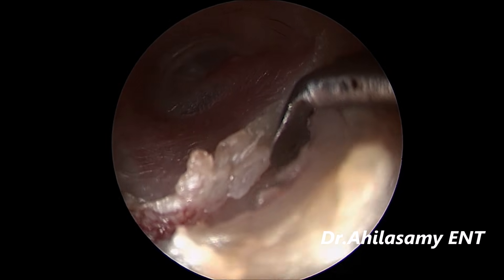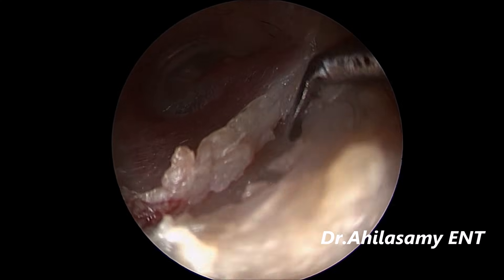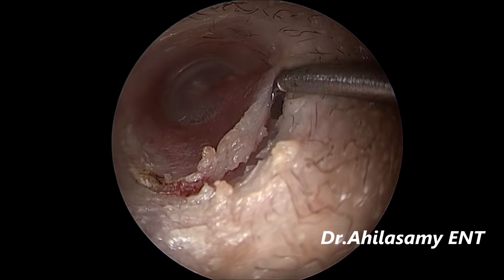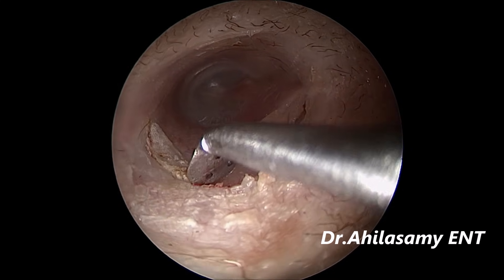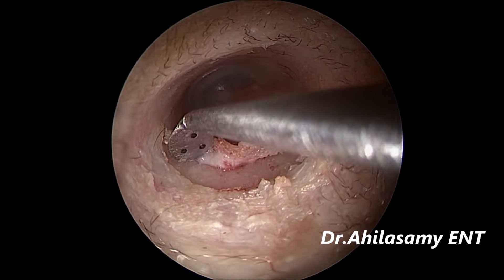See the absolutely very minimal, bloodless quality of the field — no hardships, no struggle with bleeding points.